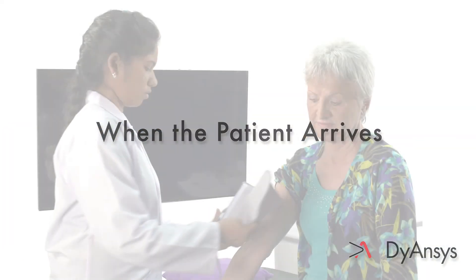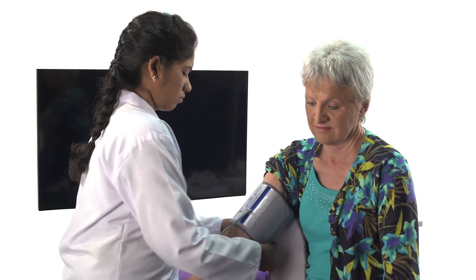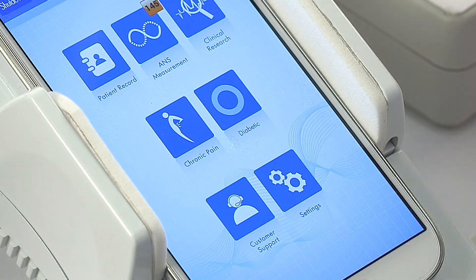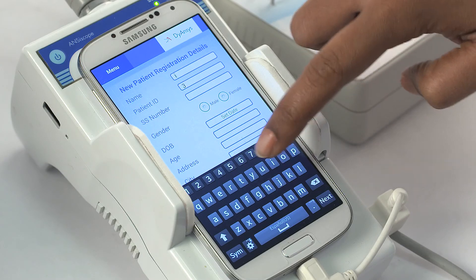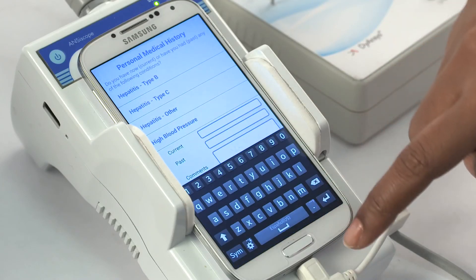When the patient arrives, determine from the initial consultation that the patient is a candidate for PSTEM therapy with Ancistim. Turn on the Anciscope cradle first and then the display unit. Set up a new patient in the patient record. Measure the patient's weight and blood pressure and record these in the patient record on the Anciscope.